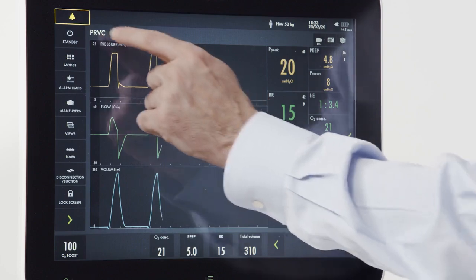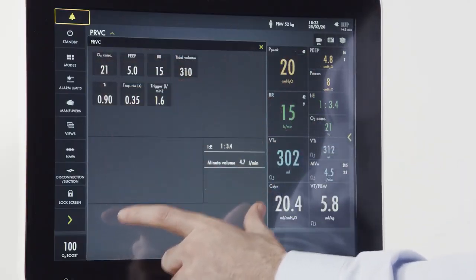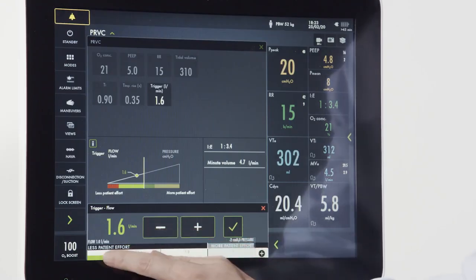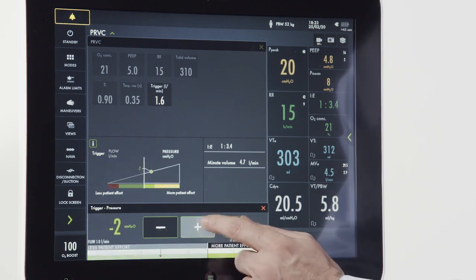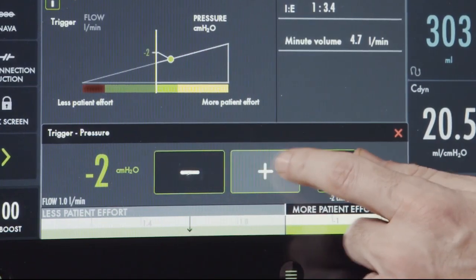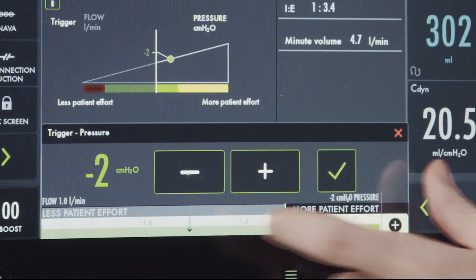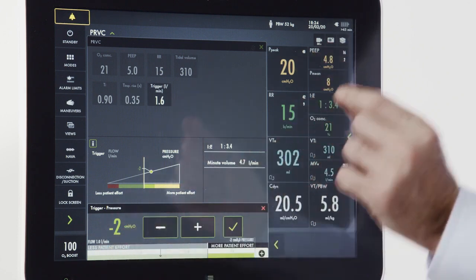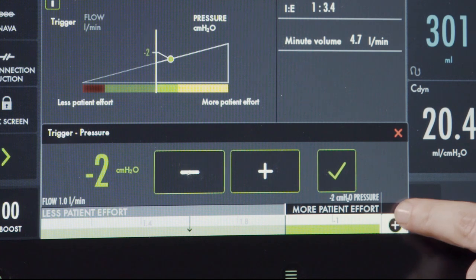By accessing our mode settings, we can now see all of the settings for this particular mode. For example, if we were to choose the trigger, we could increase or decrease it at the bottom. If we increase the trigger to a max number, you'll notice a plus on the bottom of the screen — this is the safety scale. These are the most commonly used settings. To set a setting outside of the most commonly used, acknowledge the safety scale by tapping plus.